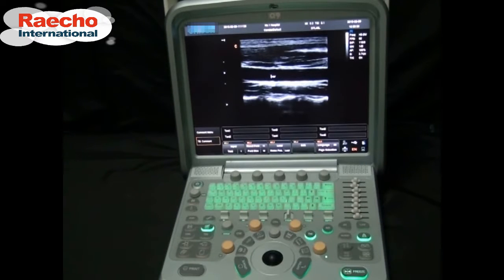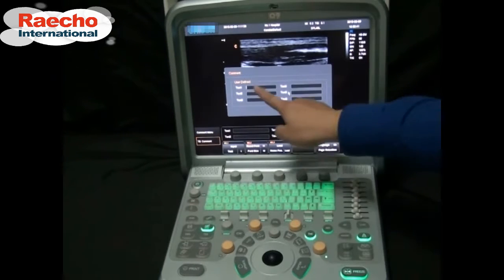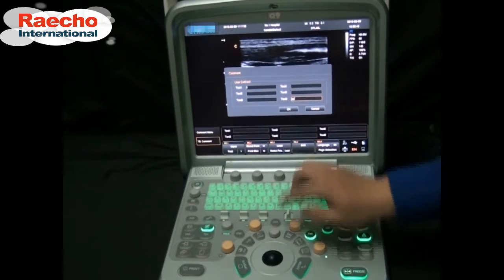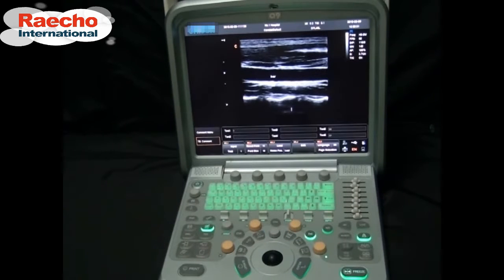We can also add our own quick comments. Here at number 4, we click edit, and it will allow me to add 6 custom comments that would come down right here for quick use. You would enter it here. Click OK. So if you want to add that, we'll use this input.